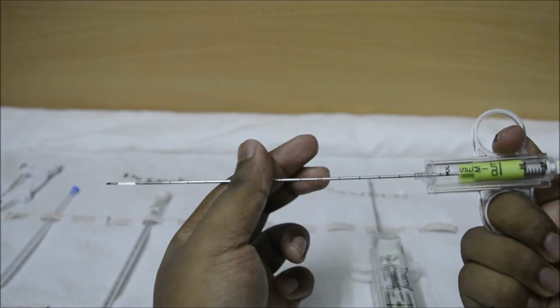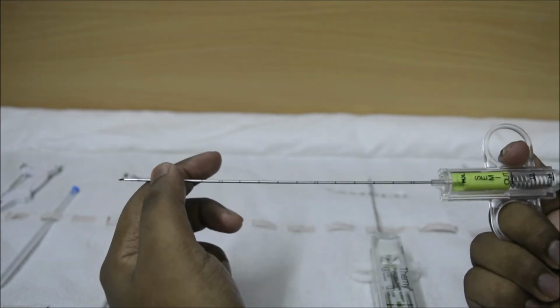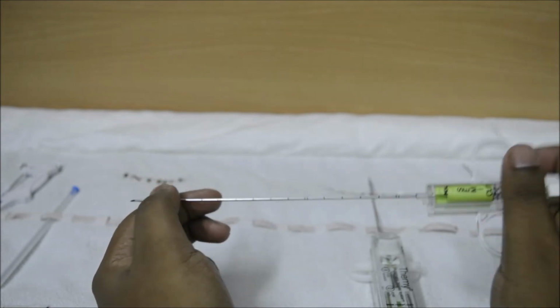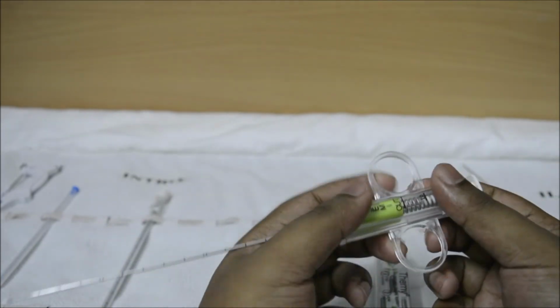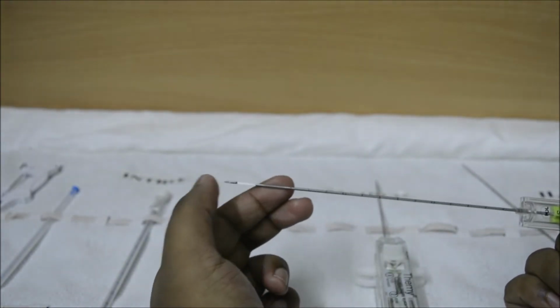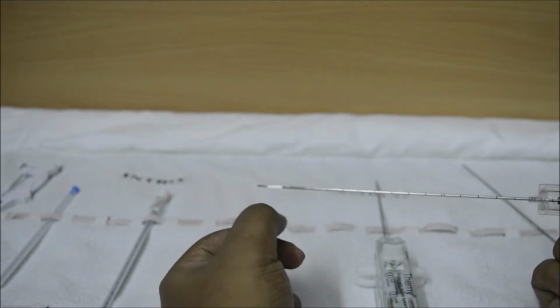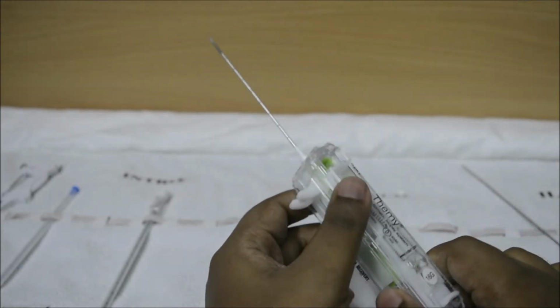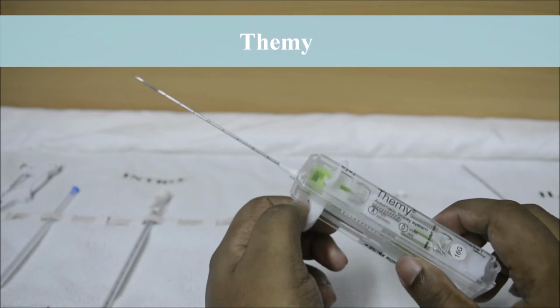The moment you push, the tray gets closed. And since the tray gets closed, we can rest assured that the sample has been safely collected. Now we take the needle out, again do the similar thing and expose the collection tray. Now you can see the sample sticking to this part, and then we take it out with a scalpel to the sample collection tube.